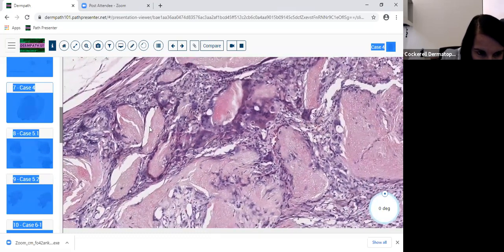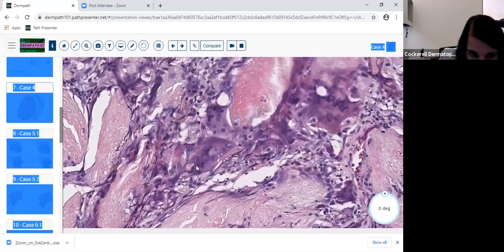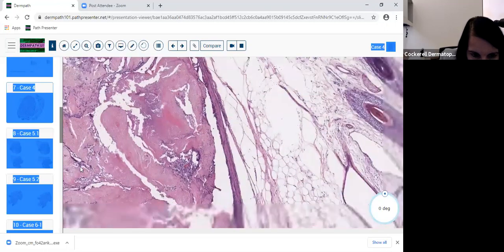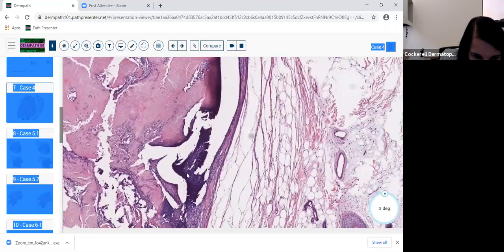These giant cells are reacting to this material, these islands of shadow cells, just like they would react to keratin in a cyst. Now, if this were a tricholemmal cyst, you would see more palisading to these basophilic areas. You would see some eosinophilic cells that had nuclei here as well. And then you'd see the lining of the cyst basically, and you'd see compact hyperkeratosis. You wouldn't see these shadow cells.